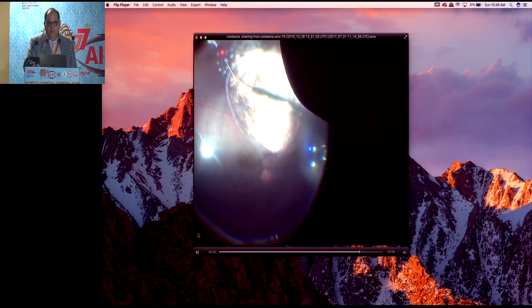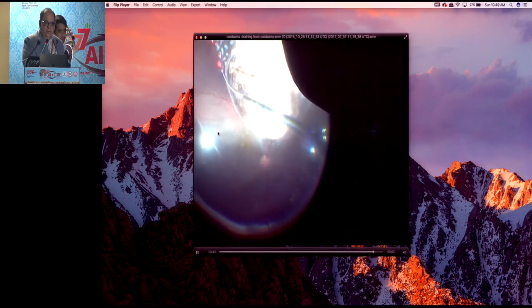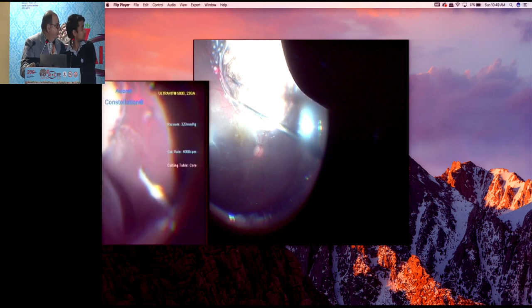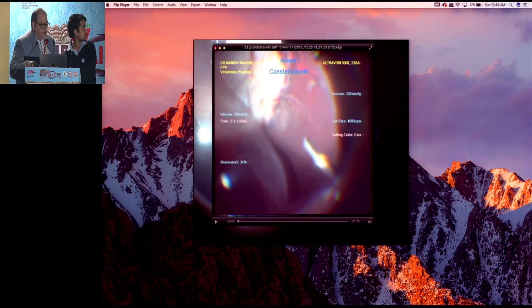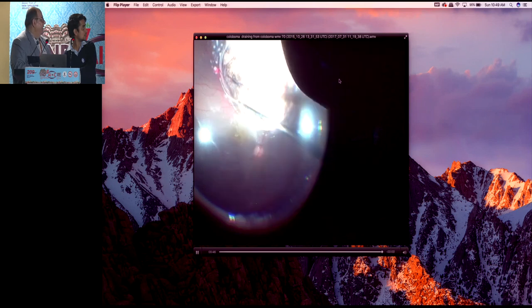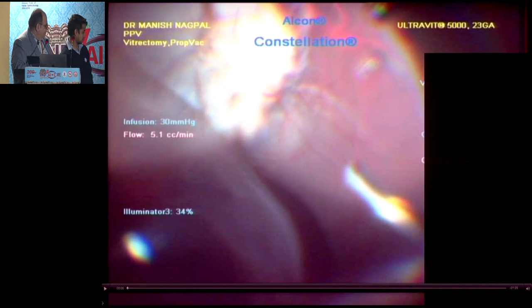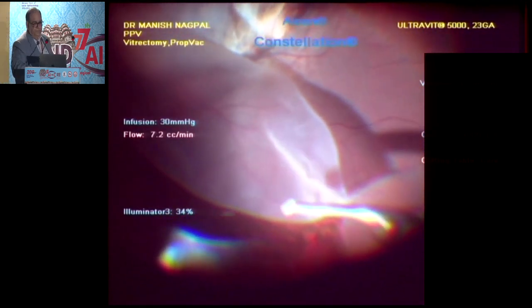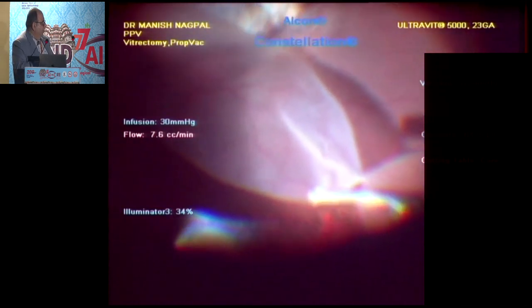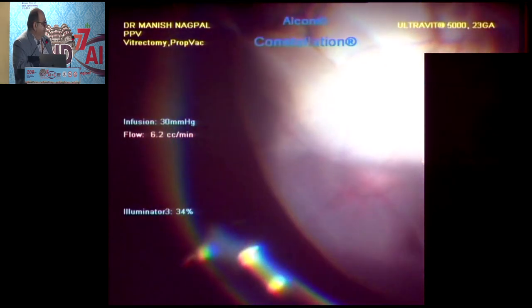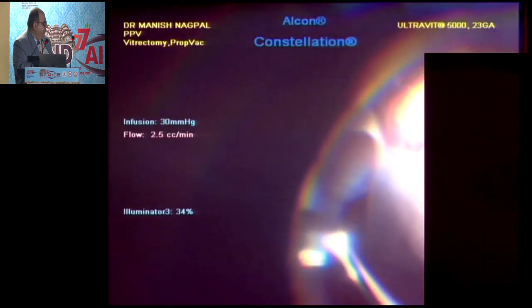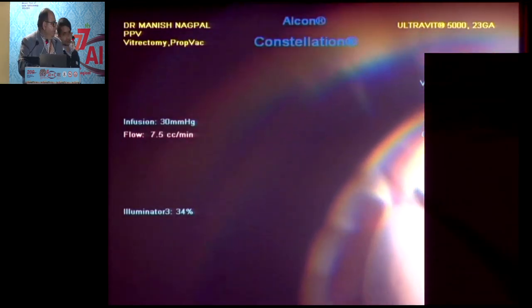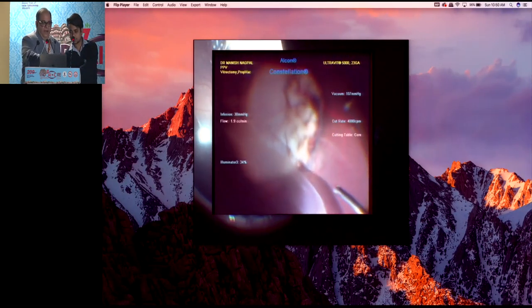This is one of Manish's cases — a giant retinal tear with coloboma coexisting. This has to be treated like a GRT and not like coloboma RD, though the break is outside. It is a regular giant retinal tear and one has to treat it like a giant retinal tear — complete surgery just like a GRT.